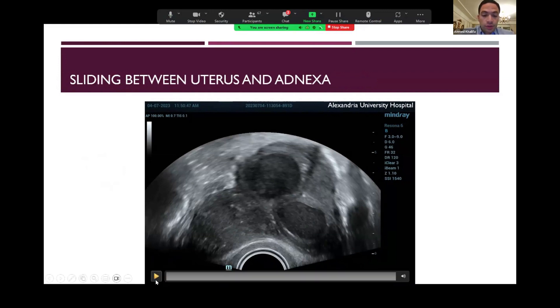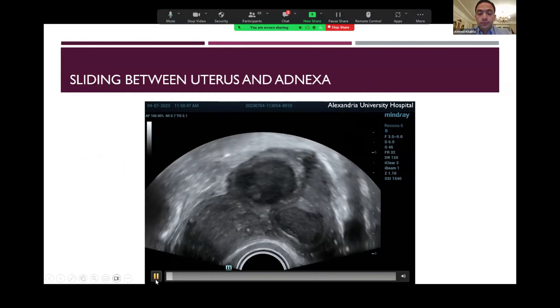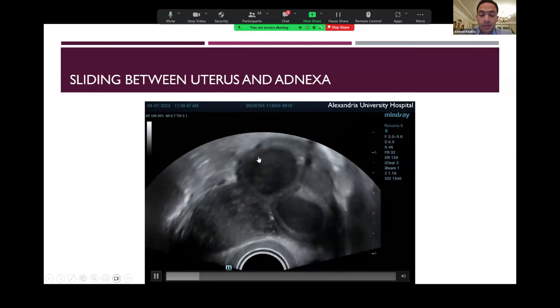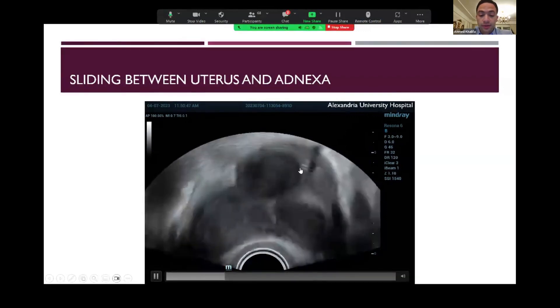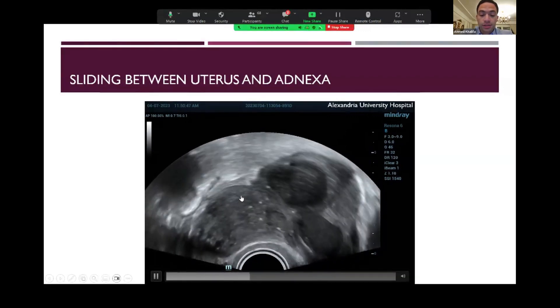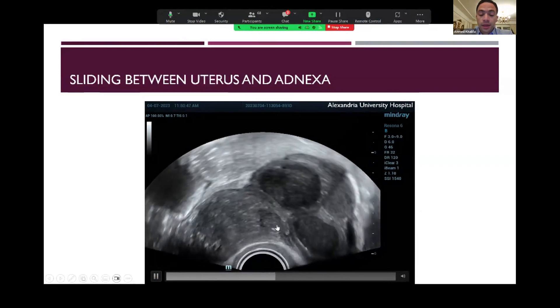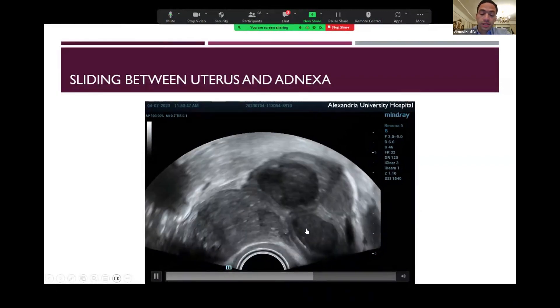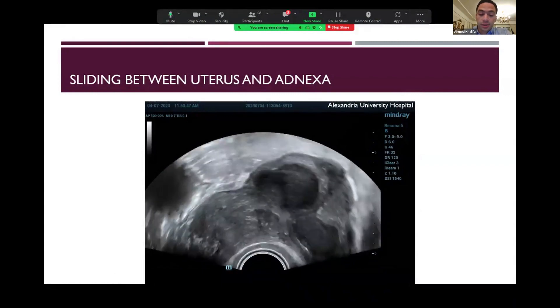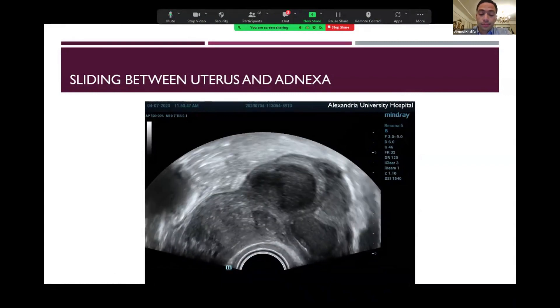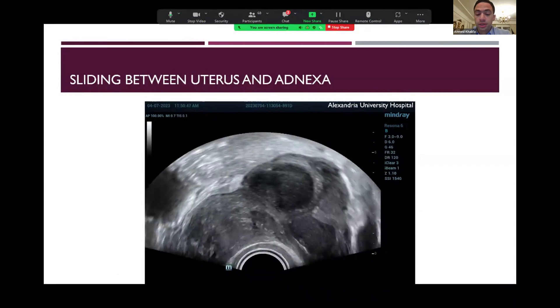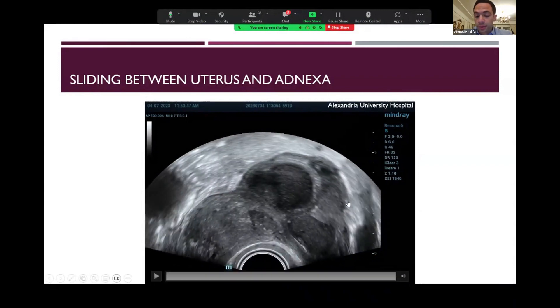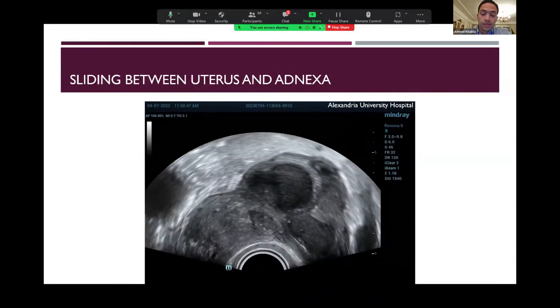We will shift to the uterus and adnexia. We can see here that one of the adnexia has multiple endometriomas, and this is the uterus in a transverse view. We will compress in between the uterus and the adnexia to check if there is any sliding and the organs are moving in opposite directions. We can see that both of them are moving as a single item, which means that the ovary is adhered to the back of the uterus.